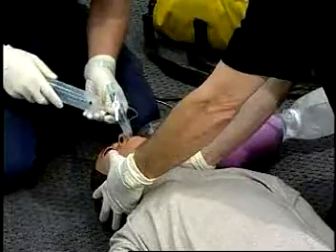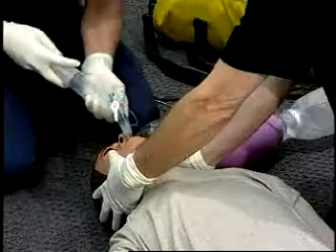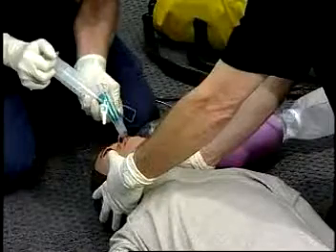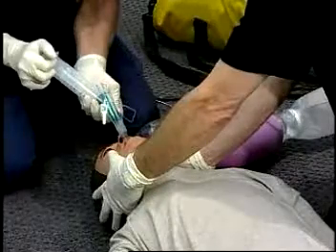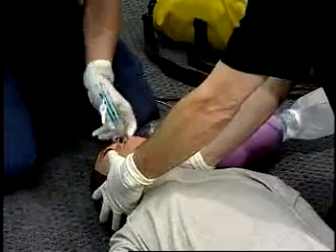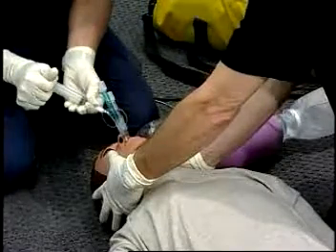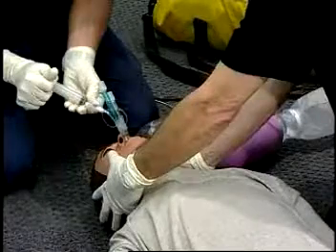Using the large syringe, inflate the pharyngeal cuff marked number one with 100 cc's of air. The device should now be seated in the posterior pharynx just behind the hard palate. Now use the small syringe to inflate the distal cuff marked number two with 10 to 15 cc's of air.